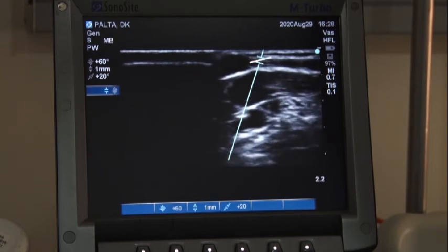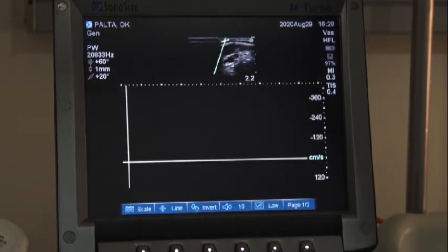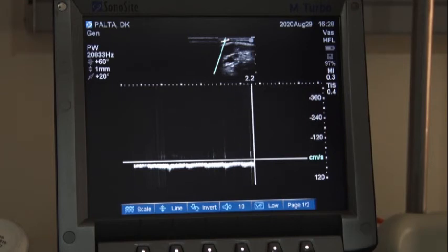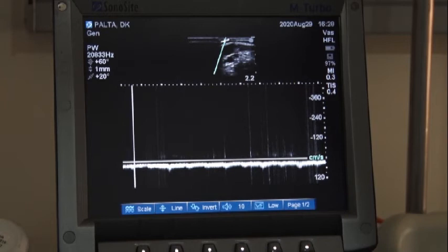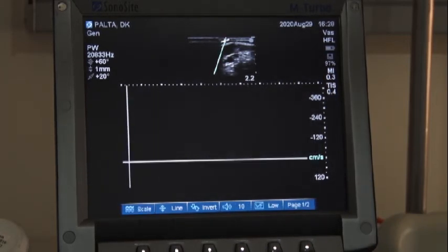One moment. One more time. We'll do this. So this is more flow.